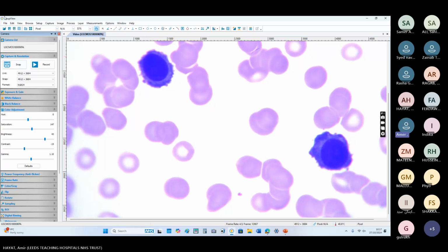The blood film has multiple plasma cells, which are likely more than 5%, representing plasma cell dyscrasia, i.e., plasma cell leukemia. But we need to confirm this diagnosis on flow cytometry. In the bracket, you can write: if it is CD56 negative, it is plasma cell leukemia. If it is CD56 positive, it is multiple myeloma.